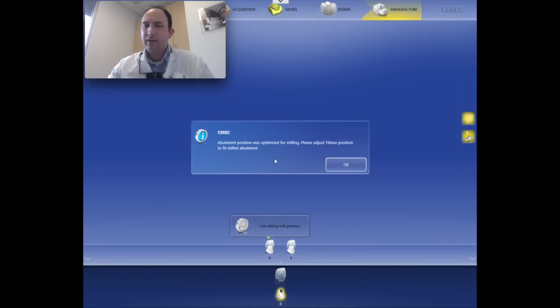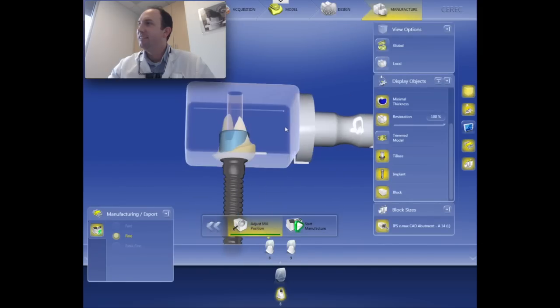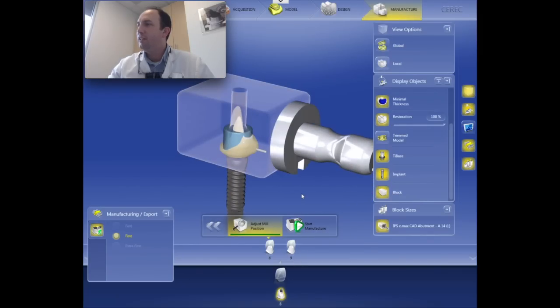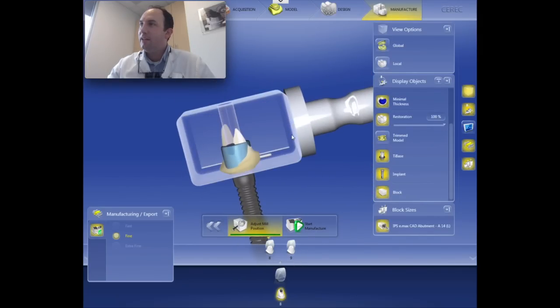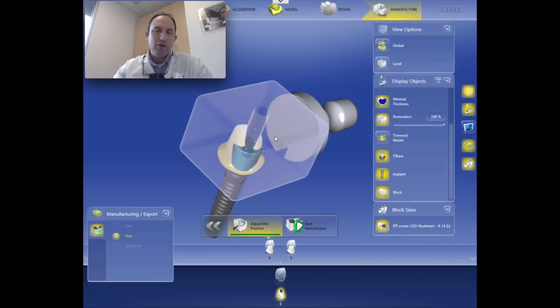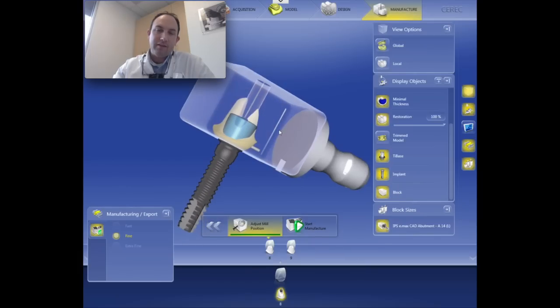All right, so it's gone ahead and adjusted our milling abutment position, so the sprues can now be in a different place than we thought it was going to be. Hopefully that won't create some challenges. Let's see. Okay, that's a favorable position there. All right, I'm going to get these milling. And I'm going to mill these out of the MO blocks, the little white MO blocks. Or the medium opacity, they're really white, bright white blocks.